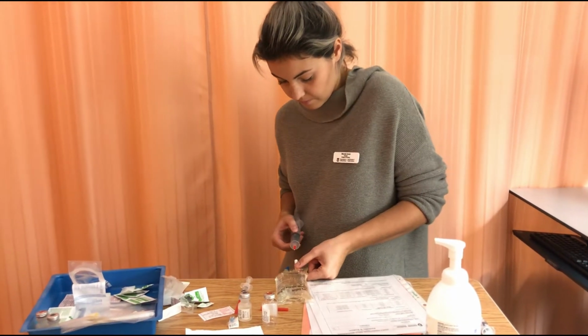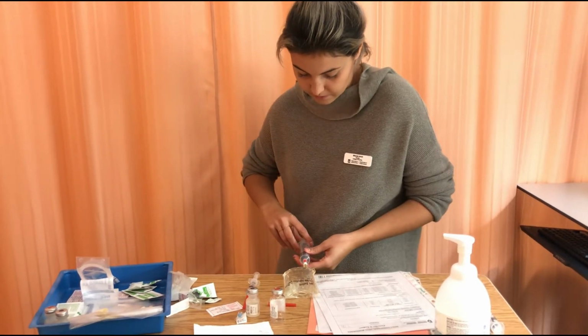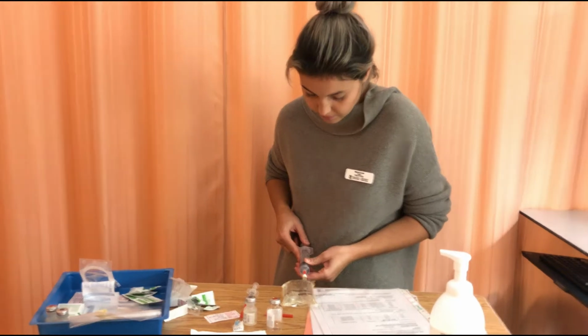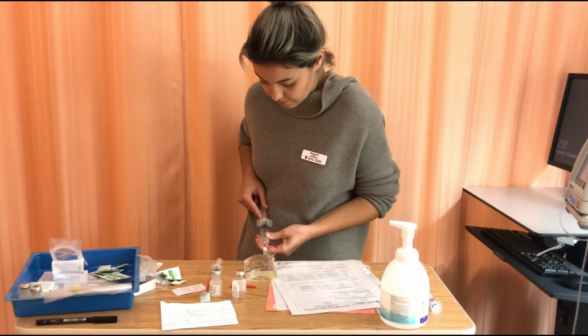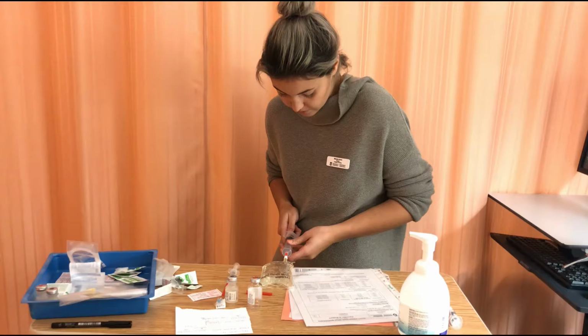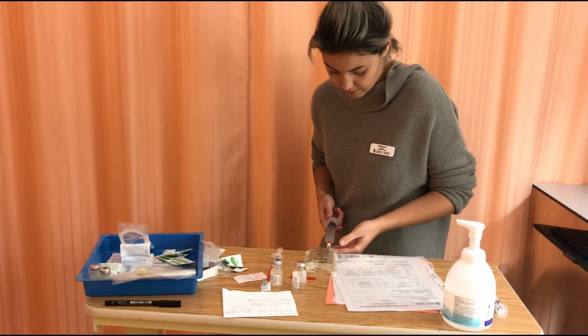So I'm removing the tabs, so now I'm going to enter the patient's room. Using the safety check, swabbing for 30 seconds. Side rails are up. I'm going to do my hand hygiene first, and then the IV infusion is running. Patient isn't in any distress. So I need 10 ml of sterile water to reconstitute this.